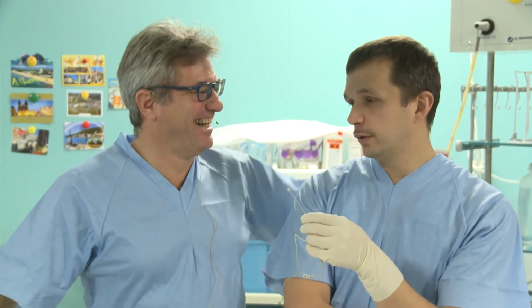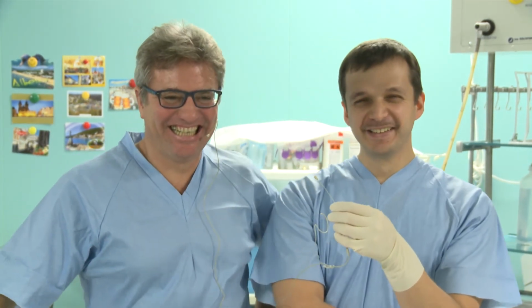I know how Alberto works, and in Russia there is a situation where some colleagues do ERCP without X-rays, but Alberto is doing draining manipulations without any X-rays, without fluoroscopy, only using EUS. It is really possible. A question, please.